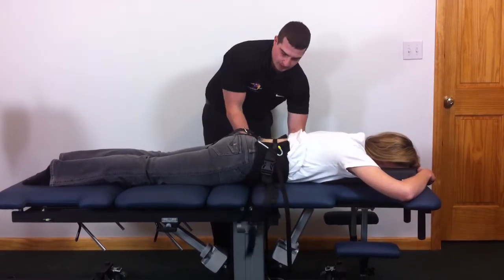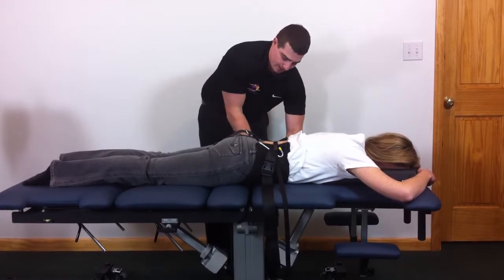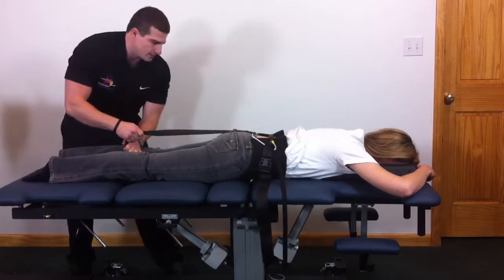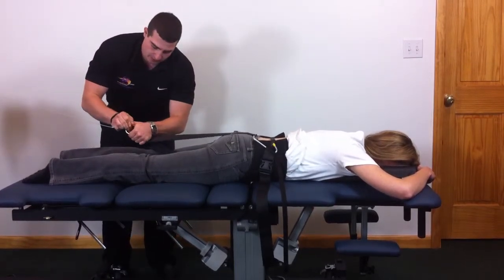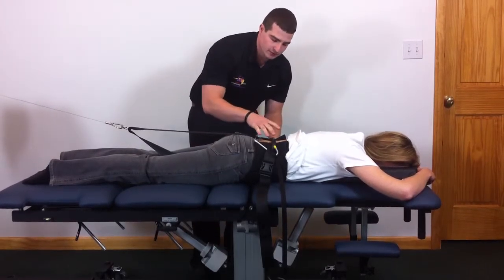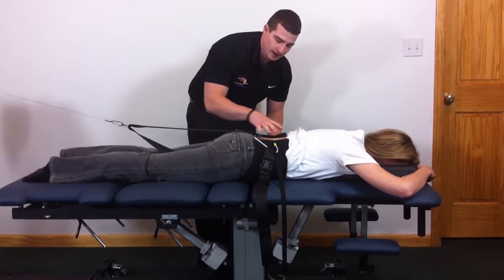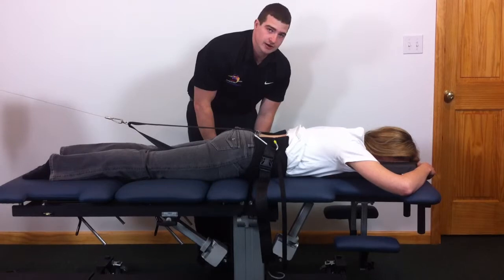Then do the same on the other side. You want to make sure you put this belt a little bit more snug than a normal belt. Tension the belt and hook your cable up to the ring. At this point you would apply your stim pads, or do your ultrasound or laser. You can also remove this strap after the belt is applied, so you have the open part of the back to do your modalities at the same time as your traction.